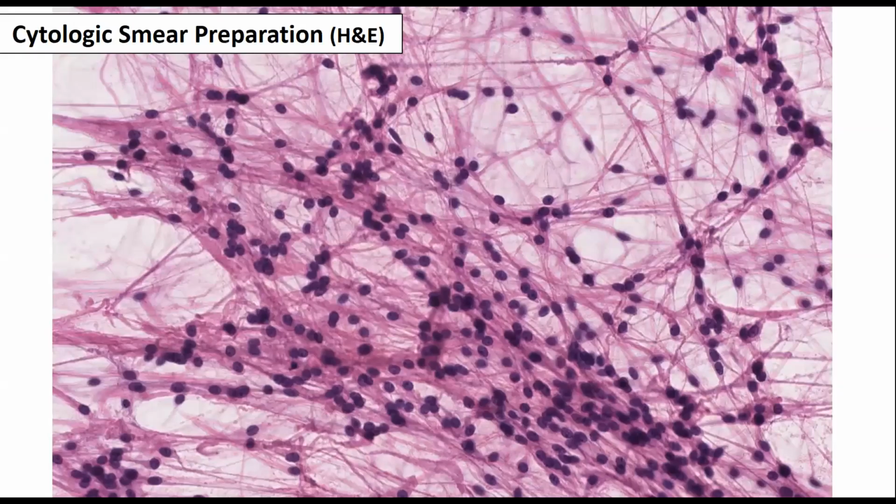Anybody have a clue? Obviously, I hope that you're thinking glioma, because of these fibrillary, long, elongated cell processes. Now, here's where you can't get sloppy. So far, all we have looked at is just one domain of the information in this smear, the cytoplasm. Is it absent? Is it vacuolated, like a perinuclear halo? Is it epithelioid? Is it long, elongated like fibrillary? Is it really elongated like pilocytic, hair-like? That's the cytoplasm. And what we have is fibrillary, or long processes.